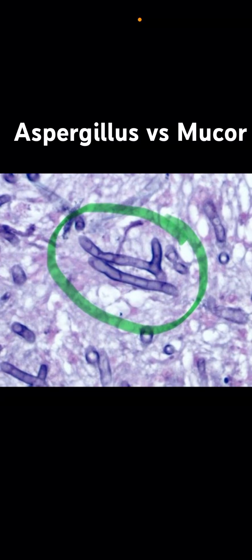We're going to talk about fungal hyphae. The first one I want to show you has narrow-angle branching and septa within the hyphae, shown within the green circle. This kind of morphology in the lung usually represents Aspergillus, but not always.